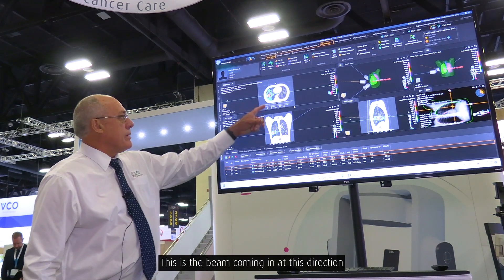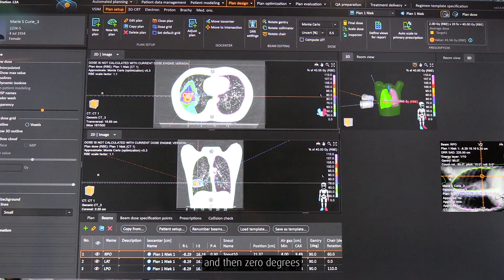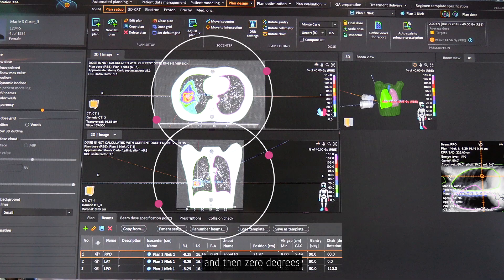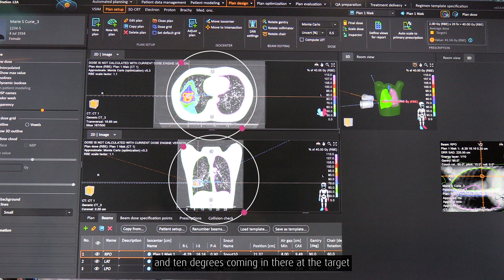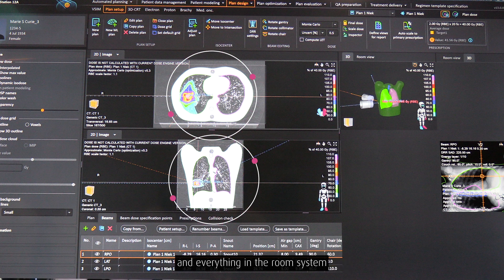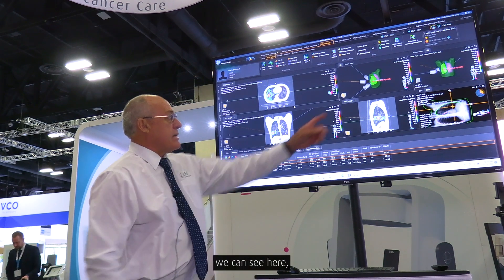This is the beam coming in at this direction, then zero degrees coming in here and 110 degrees coming in there at the target, all within the room coordinate system.